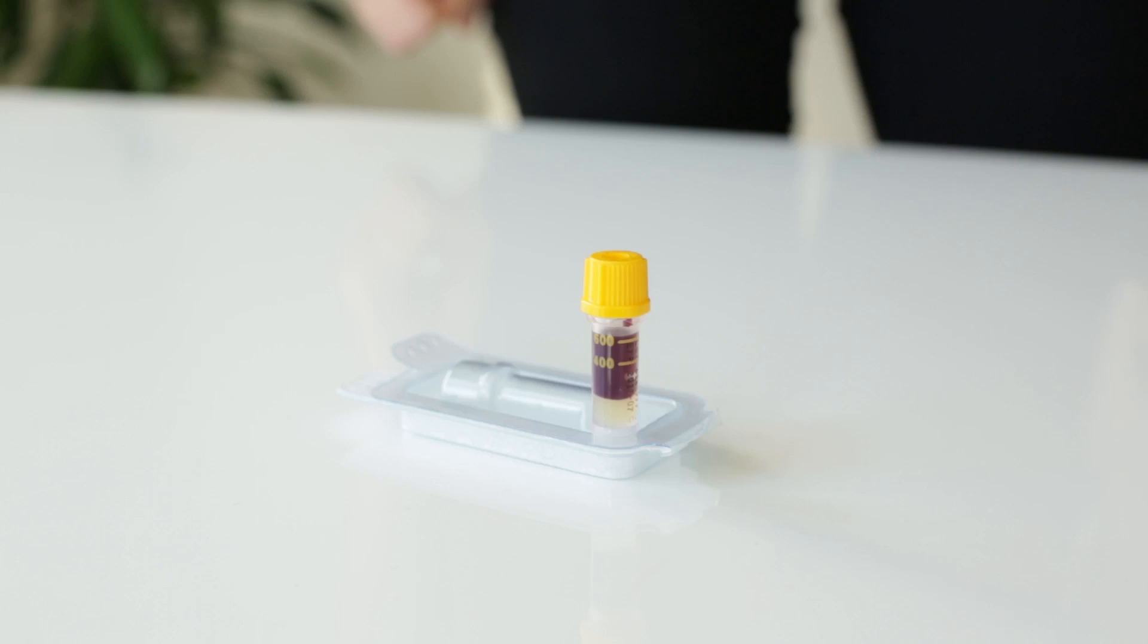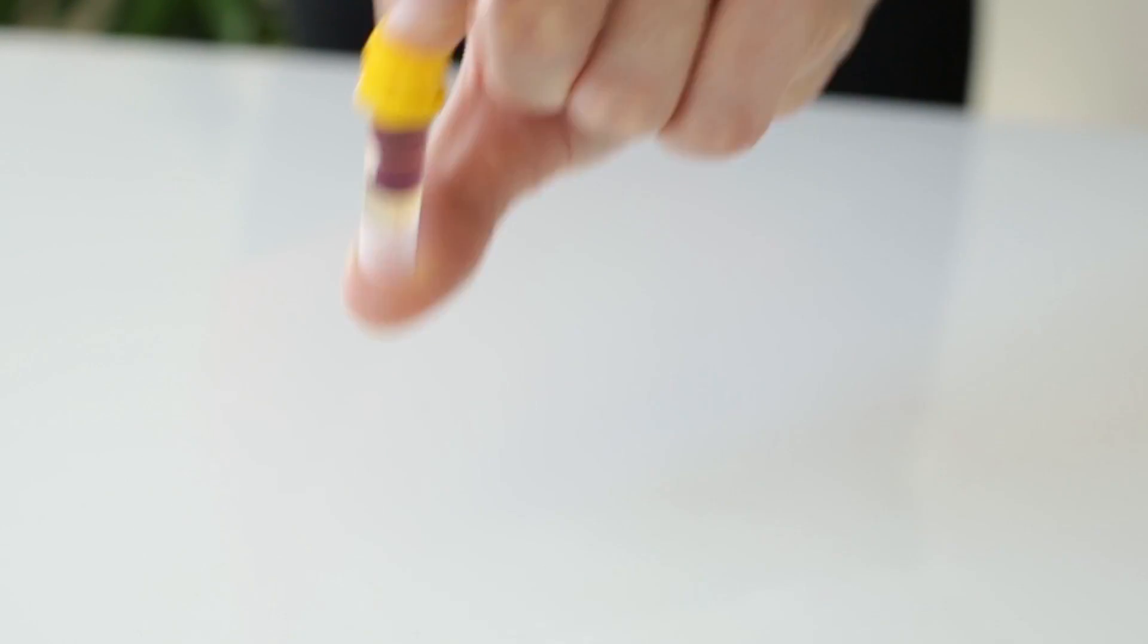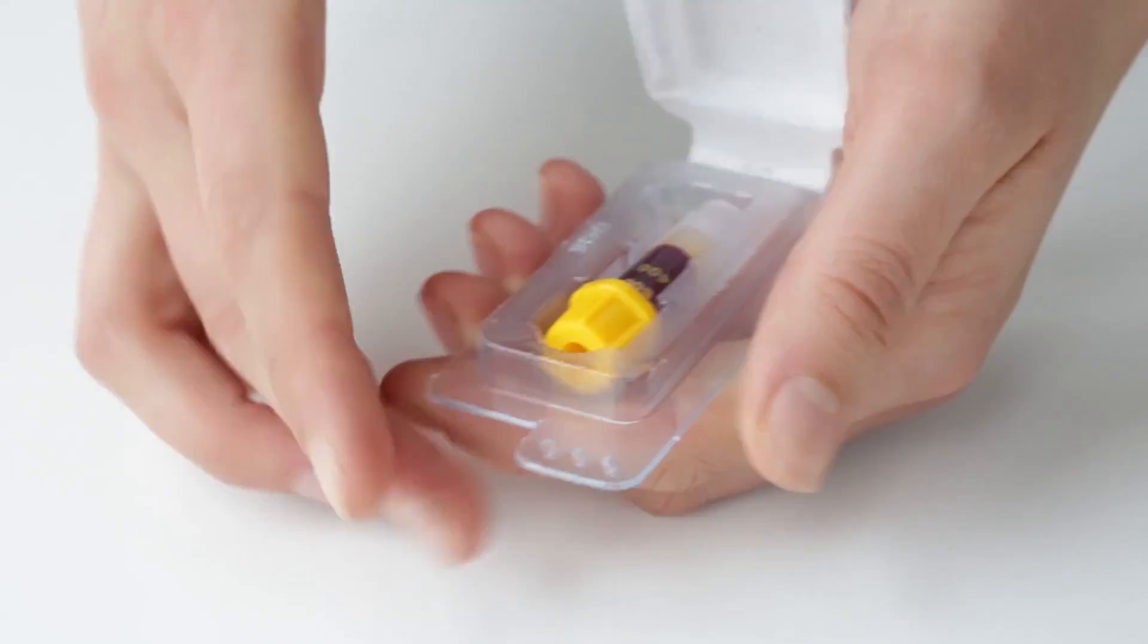Push the yellow cap firmly back onto the tube. Gently turn the tube upside down five times, then place it back into its protective packaging.